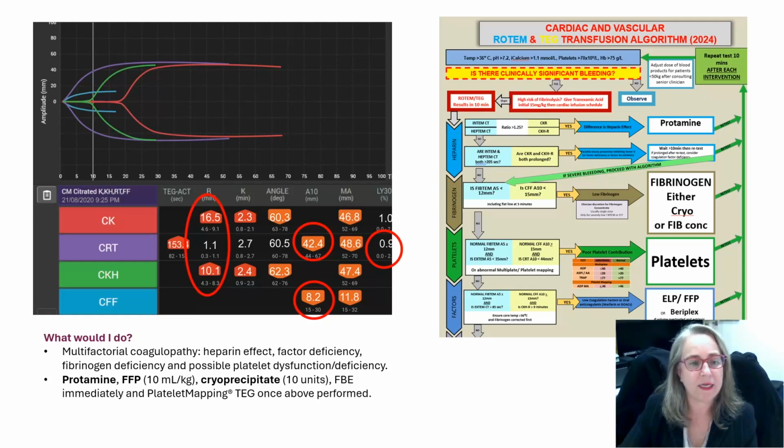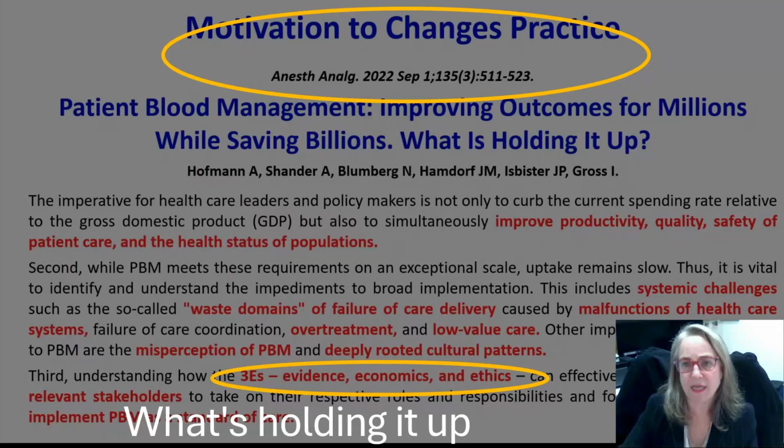We're at 42 here, we want to be 44, or fixing these top steps may correct the bottom part of the algorithm. We commonly see that. But keeping all things open in your mind, treating with protamine and fibrinogen first, and then checking what else is needed. So that's the end of my examples.